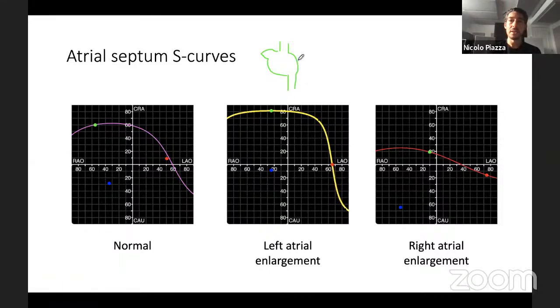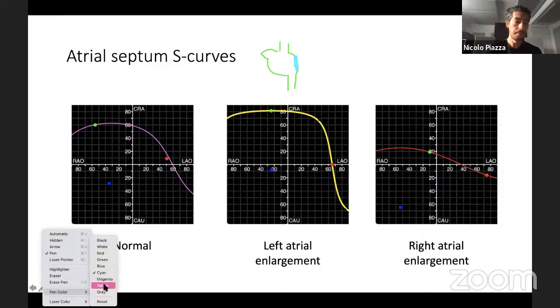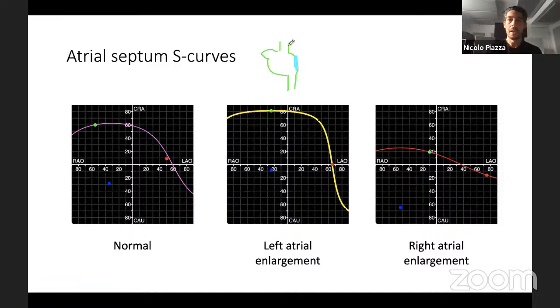If we have a rather vertical atrial septum, and by the way, this is a bicaval view of the heart, right? Because you get your SVC and IVC. For these type of patients, I'm going to come from above, and I'm going to make sure that I have a nice curve on my needle. Otherwise, you're just going to slip off.